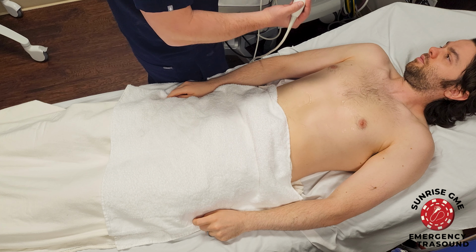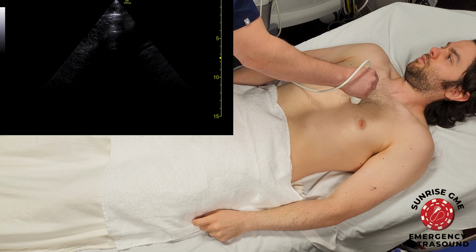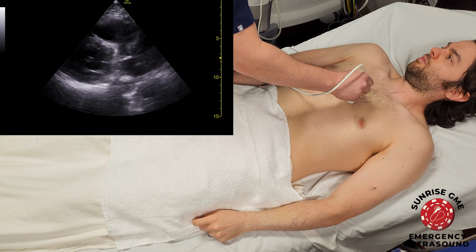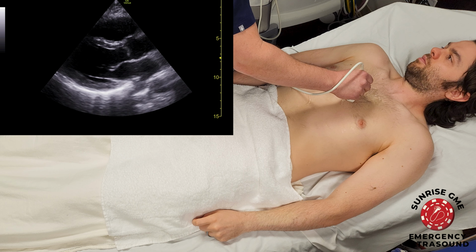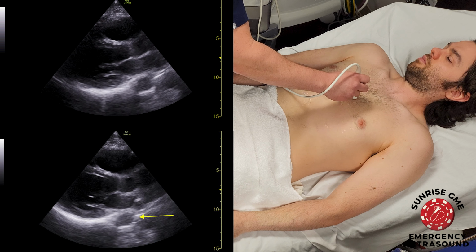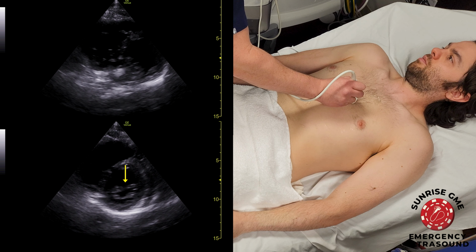When evaluating the heart, the views that are normally obtained first are the parasternal views in the long axis and short axis. These are typically obtained with the probe just to the left of the patient's sternum. Start in the second or third intercostal space and move down the chest until the heart is visible if it is not seen immediately. When your depth is set appropriately, you should be able to see the descending thoracic aorta in the far field. In the parasternal short window, it is recommended that you image at the level of the mitral valve.